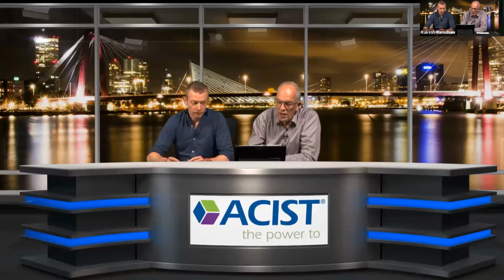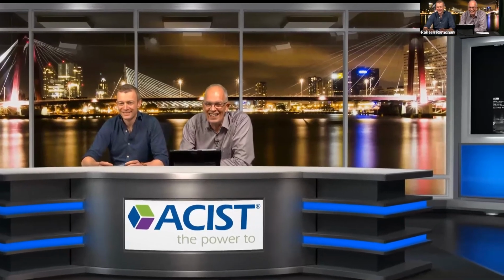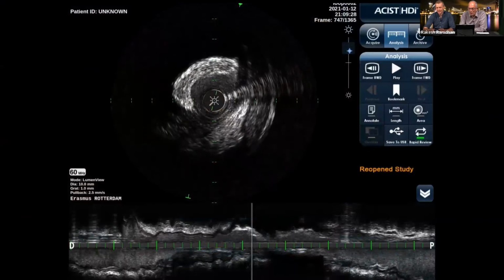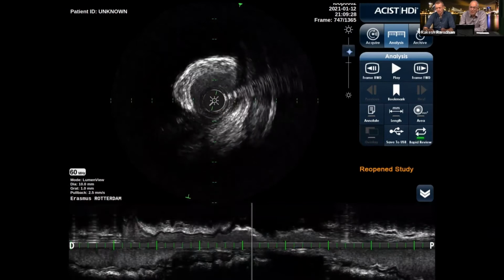I changed the brightness a little bit. Jurgen is showing it to you live now. If you go back to the screen, you can see there is one brightness part in here. Sometimes you have a more general, darker picture, and you can help that in here. Most of the time, if you start with a very dark picture where you don't see anything, then try to flush or re-prepare your catheter outside the patient, because most of the time it has to do with preparation. All right, so back to the case.